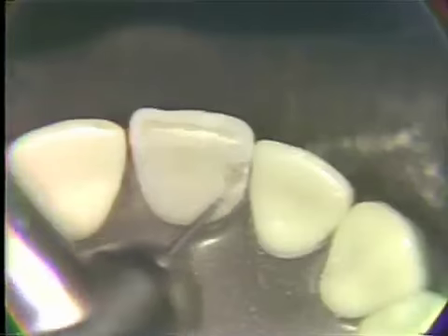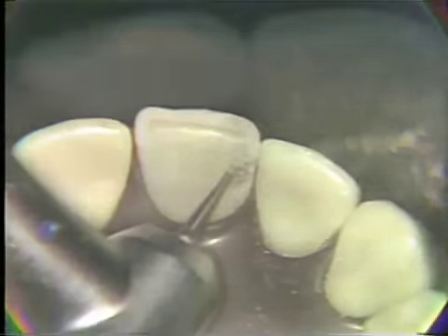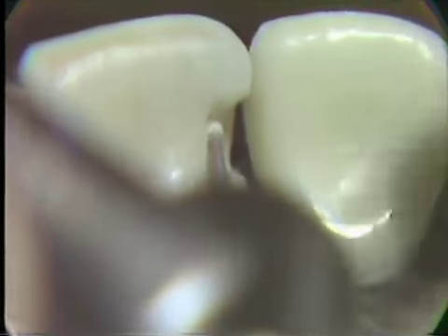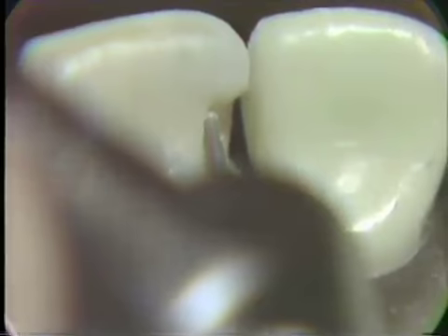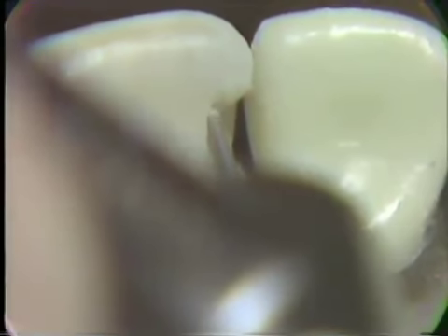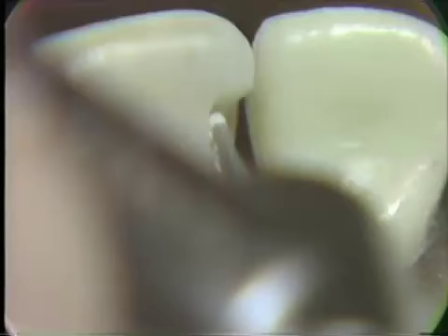And then we'll be moving into the area of the incisal for the retention. Here again, retention being placed within dentin. Very positive retention, and with an opening or a throat groove into that retentive point.